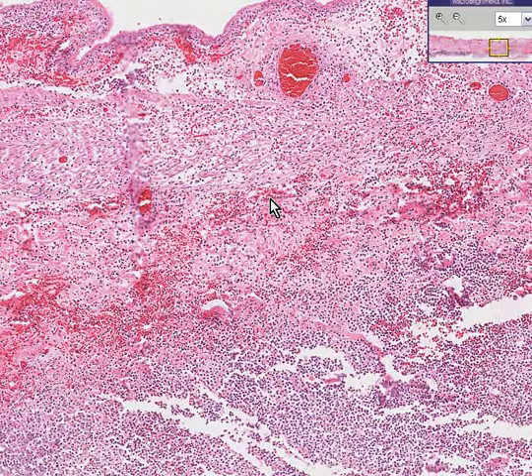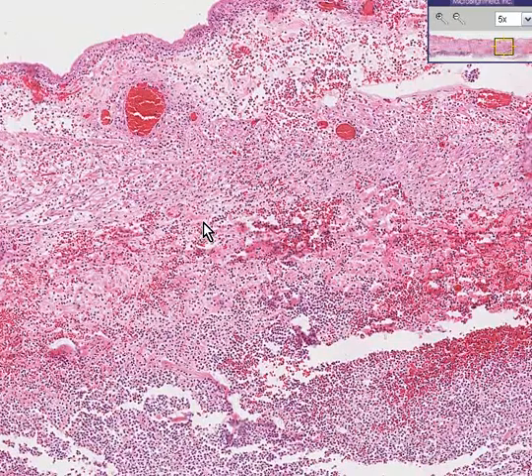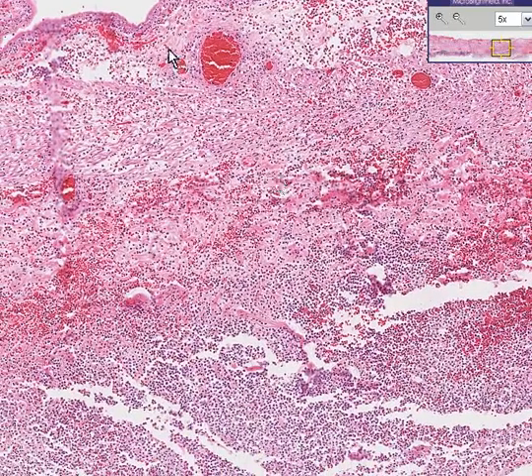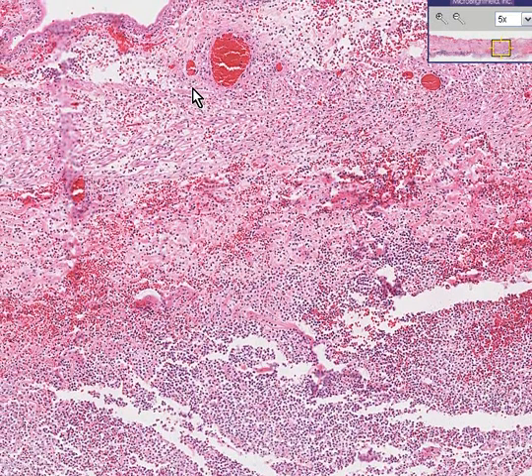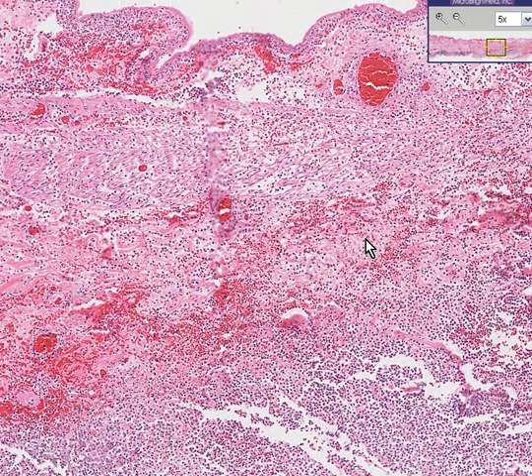In some organs, like lung classically, infarcts could be very, very hemorrhagic. In some organs, like kidneys, for example, infarcts could be very anemic or non-hemorrhagic looking, depending on the way the arteries are basically arranged. In the colon, as you could see, the pattern of infarction would be hemorrhagic. You can understand that from the fact that all the layers of the colon have these large dilated blood vessels. This would be a hemorrhagic infarct.